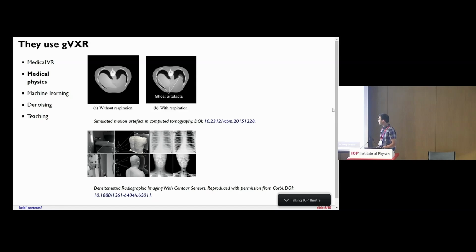One guy in Spain used it a lot to design new medical imaging modality, and basically what he wanted to do is a densitometric radiographic modality. So it's using two energies, like what you've just seen, one low energy, one high energy, and then the trouble with that, you have a higher dose to the patient. You got a much nicer image, higher contrast, but higher dose.